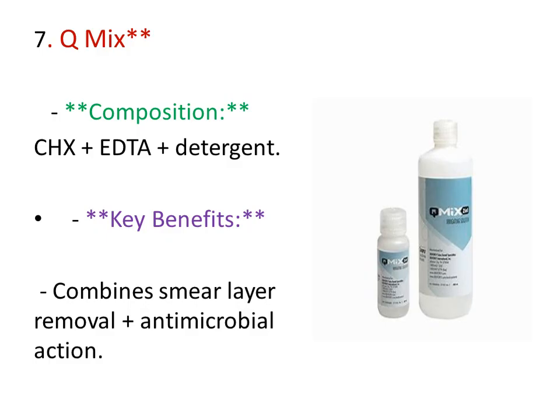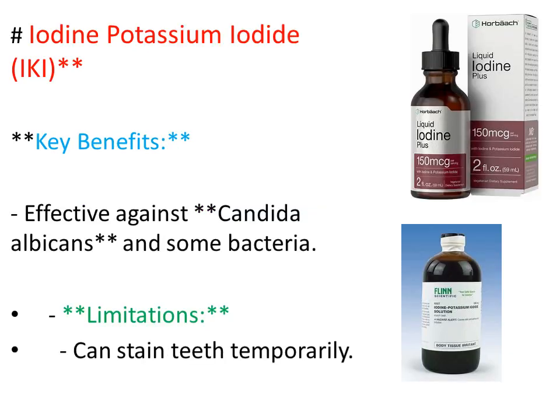The next one used is Q-Mix. It has chlorhexidine plus EDTA plus detergent. It's a combination of two or three things, and its benefit is that it combines smear layer removal and antimicrobial effects.